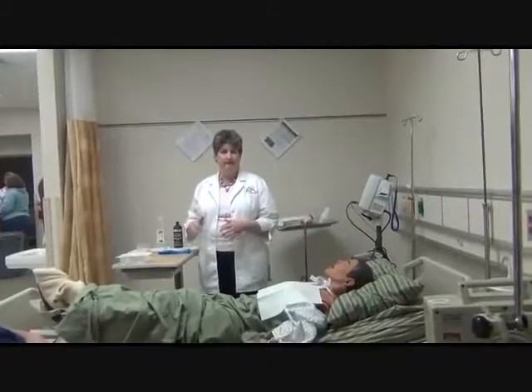Washed my hands, enter the room. We need to assess our patient whether or not they need suctioned and if we need trach care or not. You may not see an order for trach care on the chart because that is considered routine maintenance. However, you'll have a protocol on what you can and cannot do.